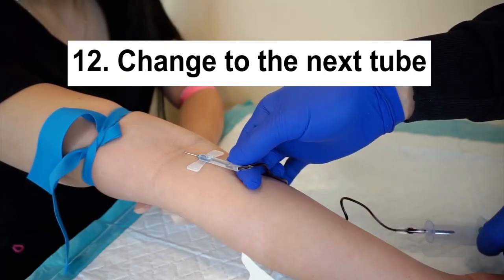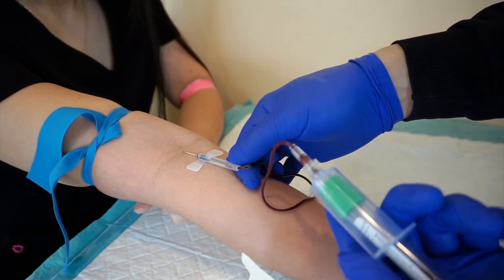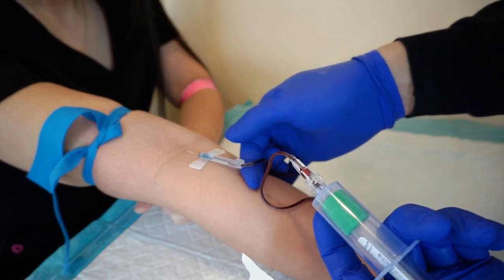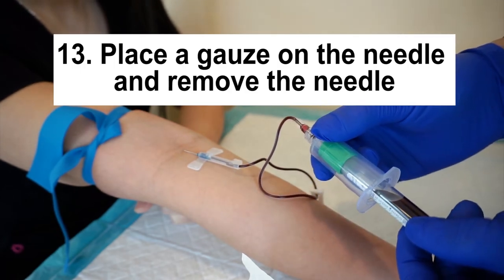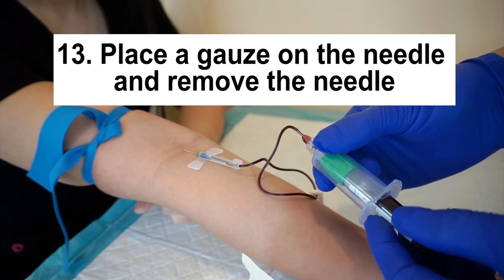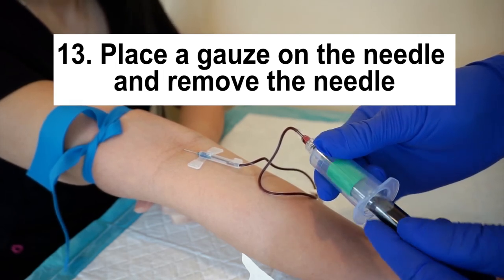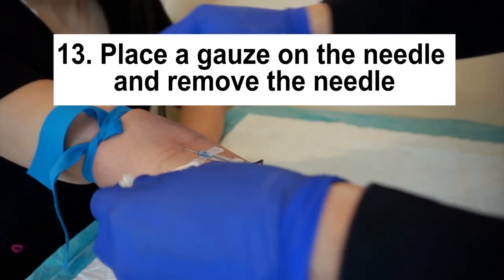Twelve. Grab the next tube and repeat the process until you have collected all the blood that you need. Thirteen. When you draw the last tube, place a gauze on the needle and remove the needle. Do not press down on the gauze because you will be pressing on the needle that is still in the patient's arm. You can also ask the patient to hold the gauze.